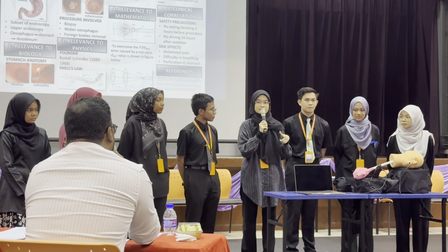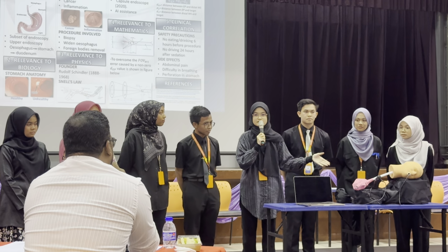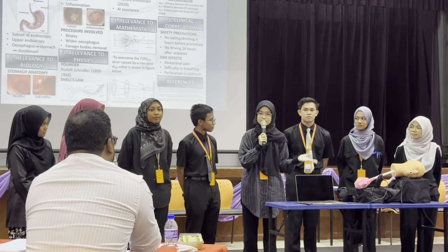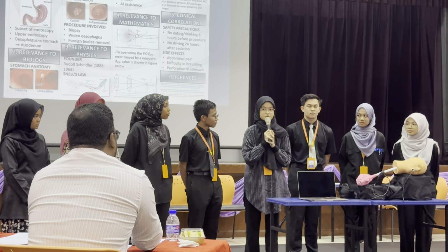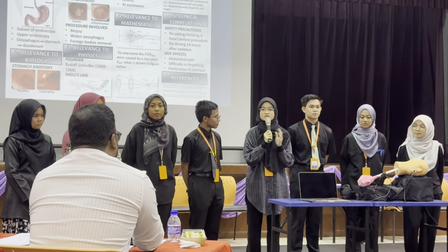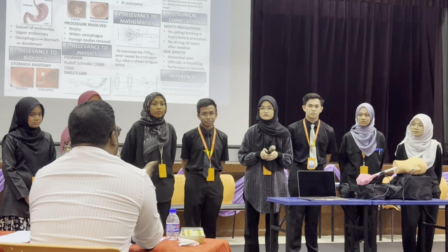Second, gravity helps to get a clearer view of the esophagus and stomach. Other than that, it is for the patient's comfort, because it is the most relaxed position. This ensures the muscles of the patient do not contract, for easier viewing of the GI tract. What do you call that position?